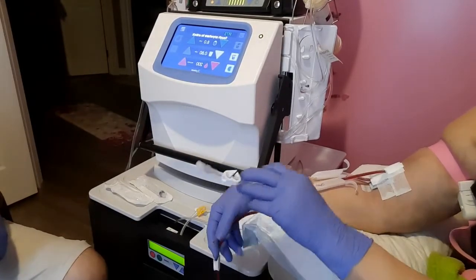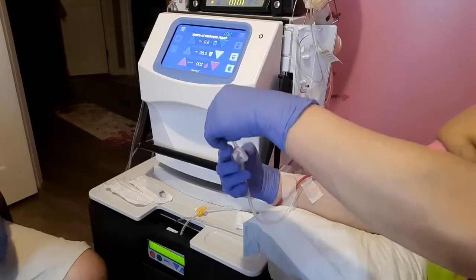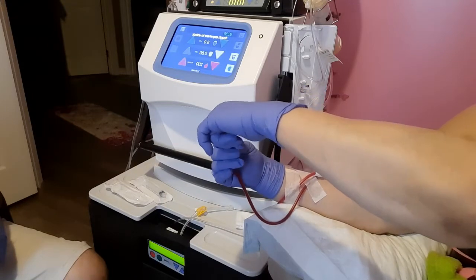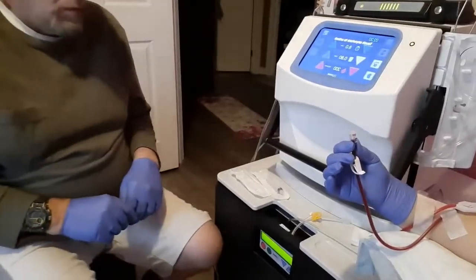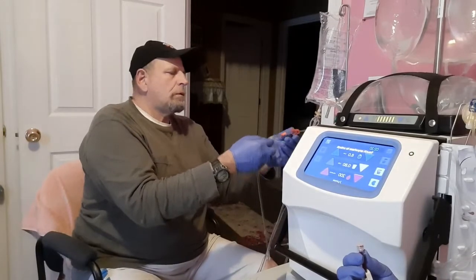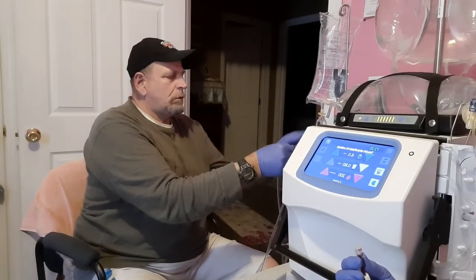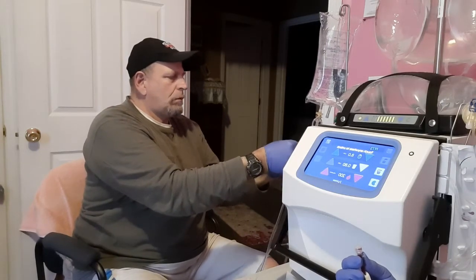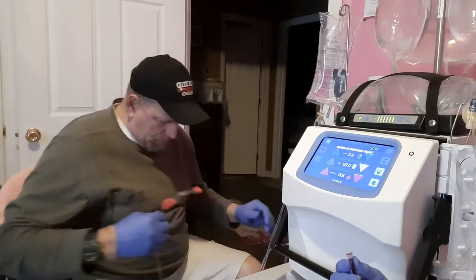Okay? Clamp is open, so I'm going to bleed back. That's a good bleed back. So I'm going to tighten the cap, clamp. Now Hofstra is going to go to the arterial, the red line, and he's going to clamp top, clamp bottom. He's going to disconnect the line. He's going to make sure the lines aren't tangled.